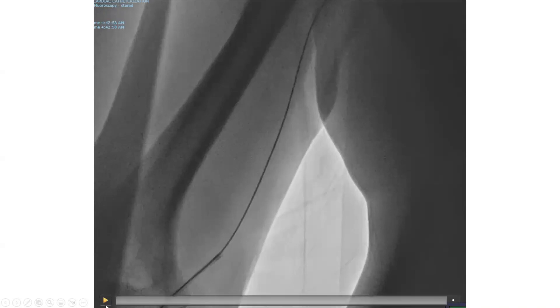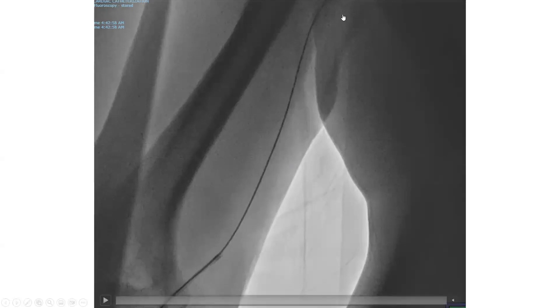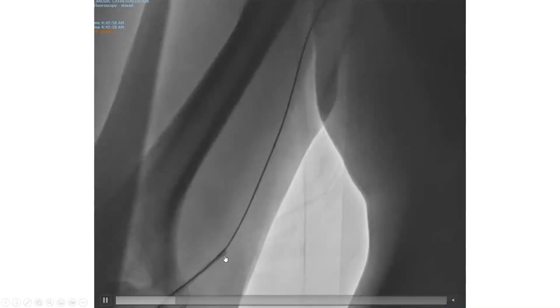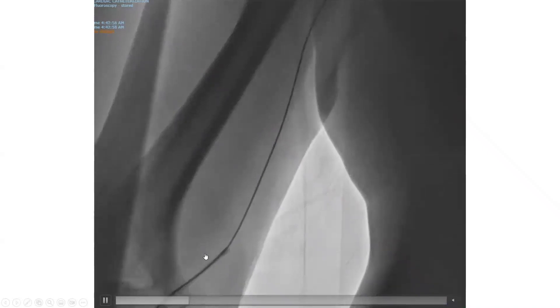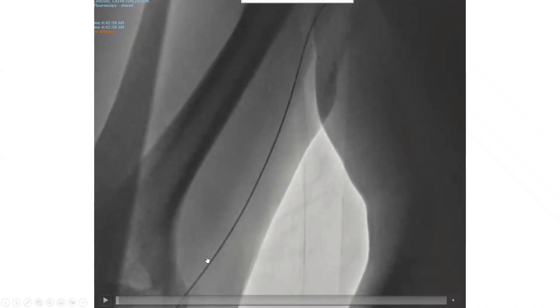This is a case of standard right radial axis. We advanced the J-wire and it went through without difficulty. However, we encountered difficulty advancing our 6 French diagnostic catheter. We encountered resistance, and the patient started to have some pain. What is your thought when you see something like this, and what is the next step? The catheter is getting stuck at the forearm or at the elbow level.